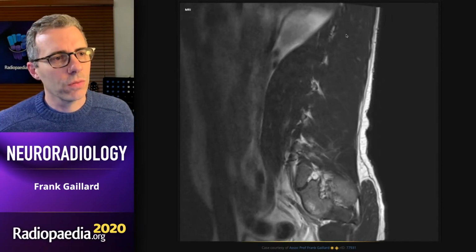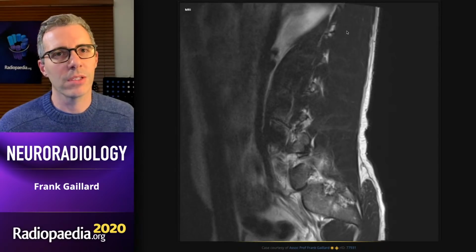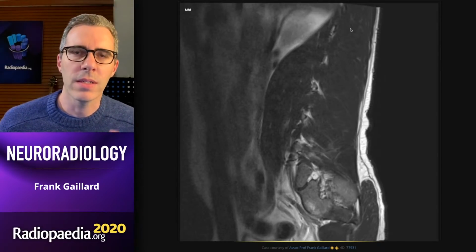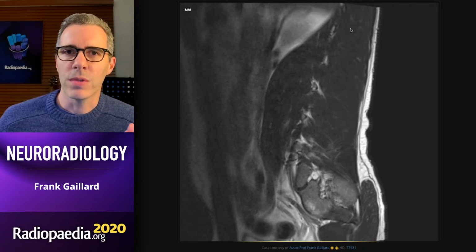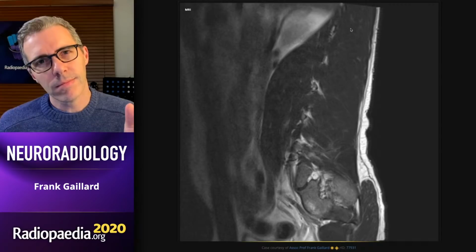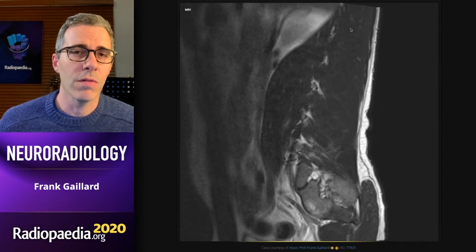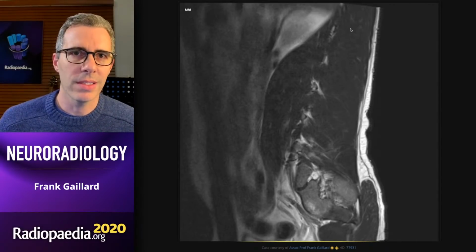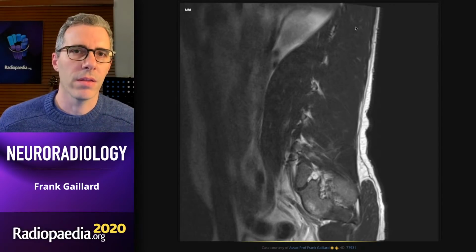While we're on sagittal, we can swing across and try and spot ribs. Now, ribs on MR are surprisingly difficult to look for. And also they're unreliable because it's not terribly infrequent to have a small stubby 13th rib, or perhaps an unfused transverse process of L1, or some patients have really terribly small 12th ribs, but it's yet another thing to put into the equation.